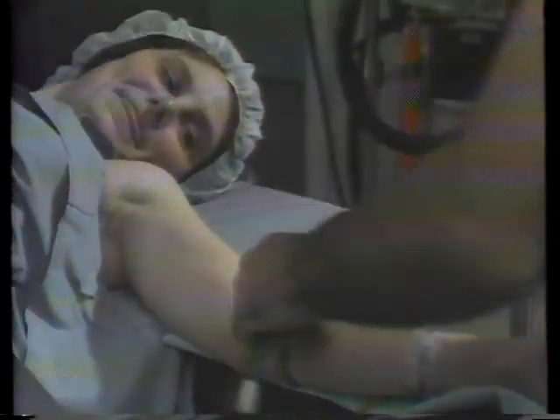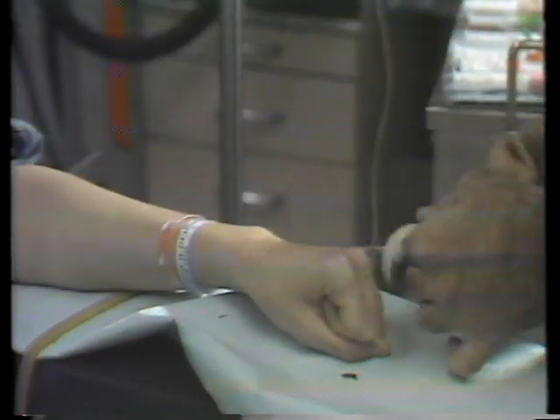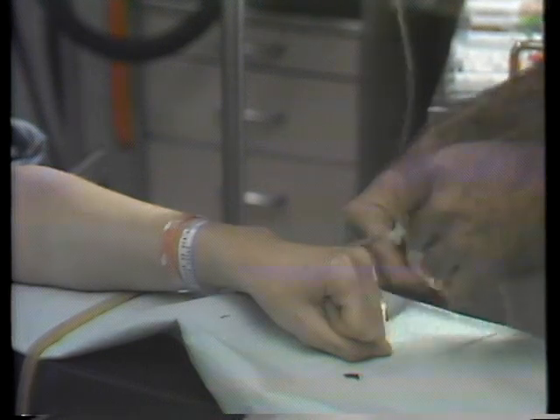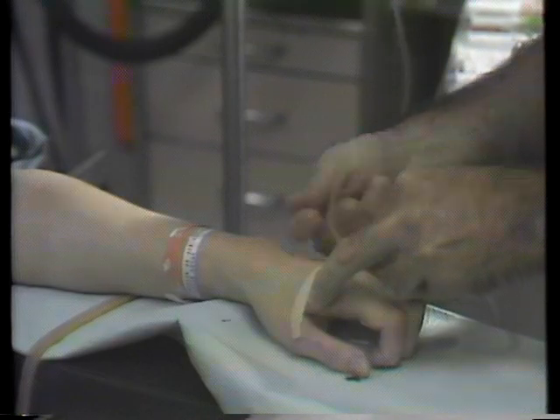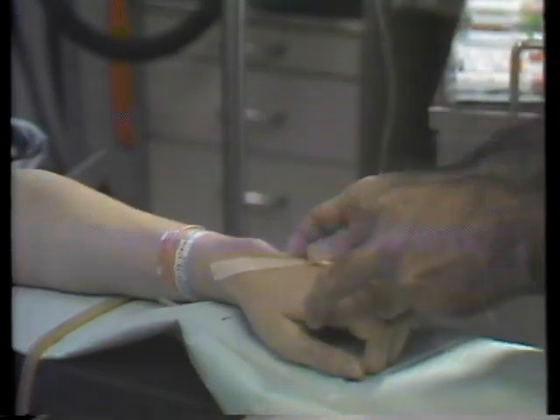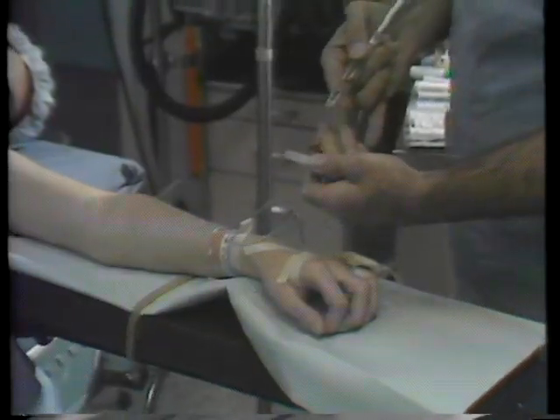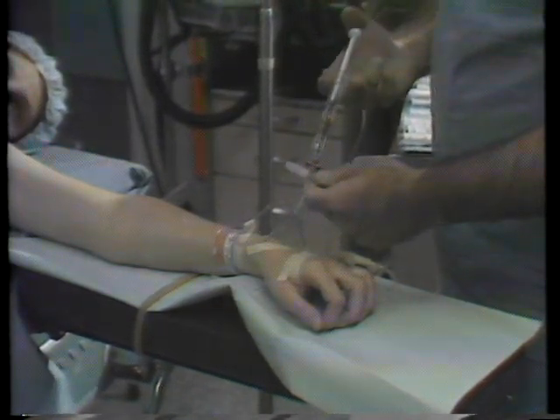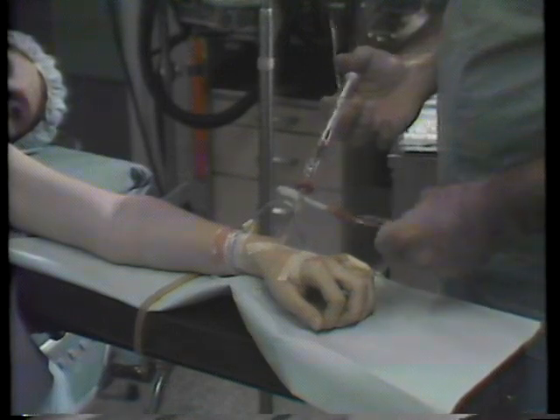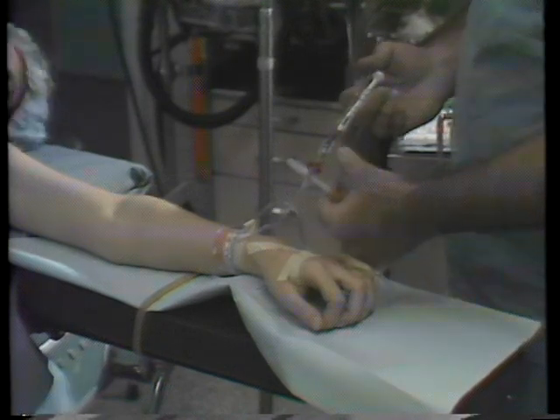There are various ways to perform the procedure; your surgeon will explain any differences to you. A needle will probably be placed in a vein — with only this one needle puncture you can receive the necessary medications and fluids. If you have chosen to have the examination using local anesthesia, such as this patient, you will be aware of your surroundings; or you could have it performed using general anesthesia so you will be asleep.